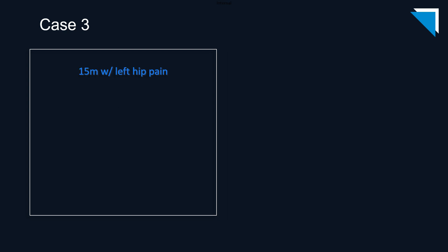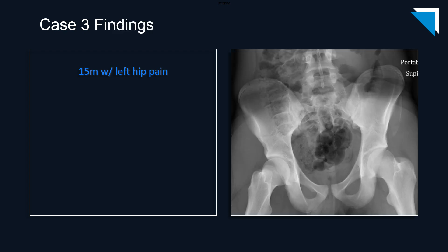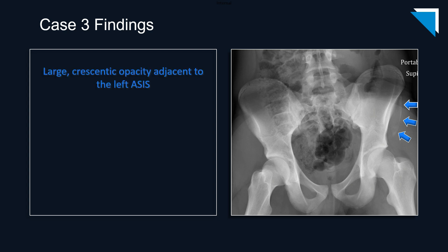Here's a similar case — this is a 15-year-old boy with left hip pain. Again, we have a single AP radiograph of the pelvis. And once again, we have a curvilinear opacity adjacent to the left anterior superior iliac spine. In this case it's much more conspicuous, consistent with another anterior superior iliac spine avulsion fracture.